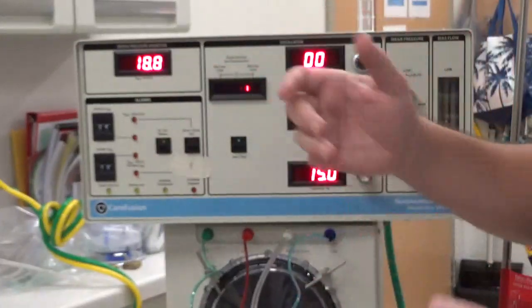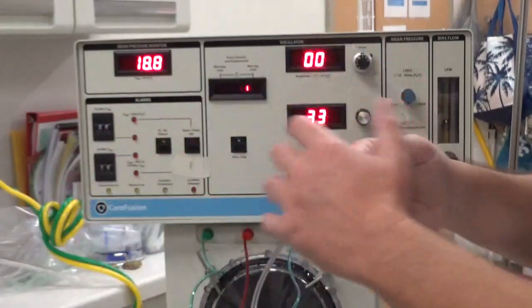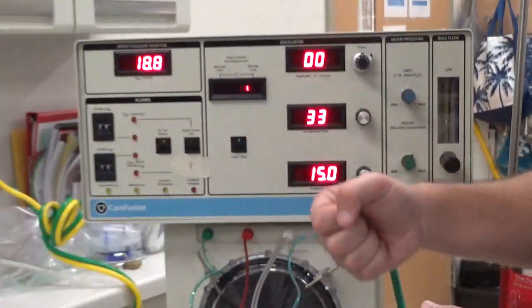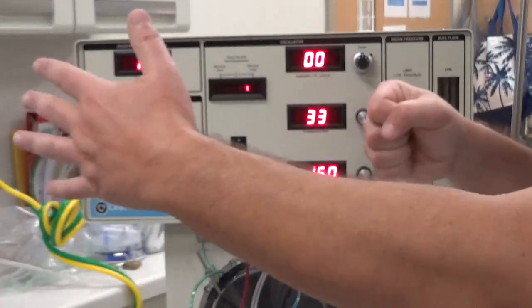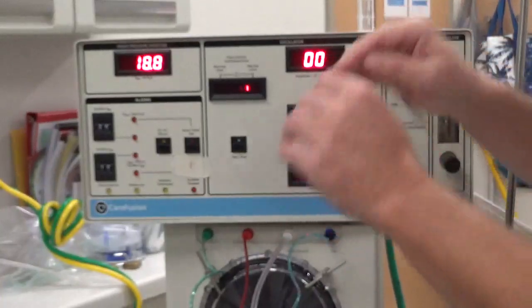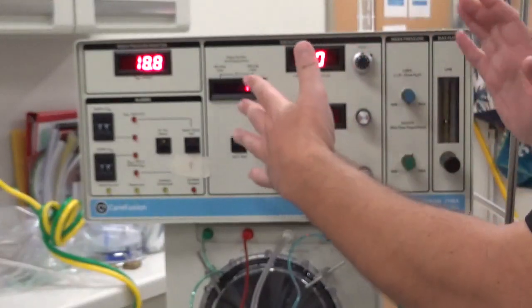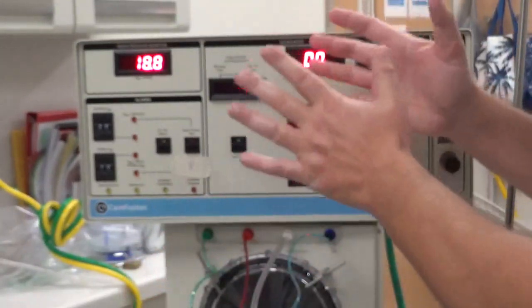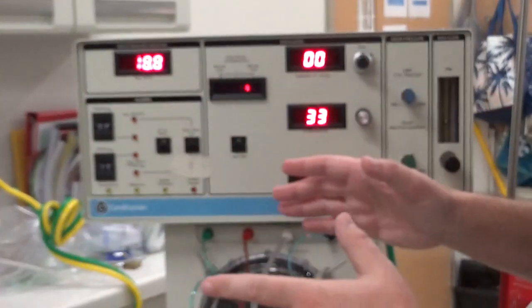Think of it like filling up a bucket of water: if you hold the water down longer, you're going to get more water. Air's the same way. If I hold the pressure down or the trigger down longer, you get more tidal volume. So every hertz you turn it down, you're going to get more tidal volume. You also get a longer expiratory time, so if there is any chance that gases are getting trapped, they have a longer amount of time to exhale. Also, this ventilator is active inspiration and active expiration. When that piston is firing, it pushes in air and it is pulling out air at the same time.